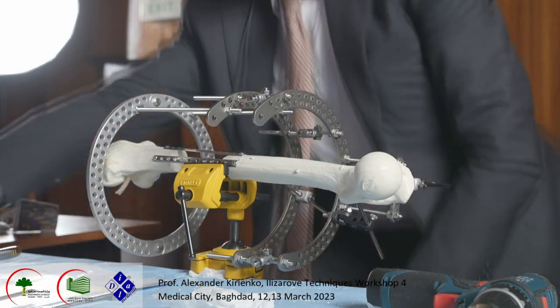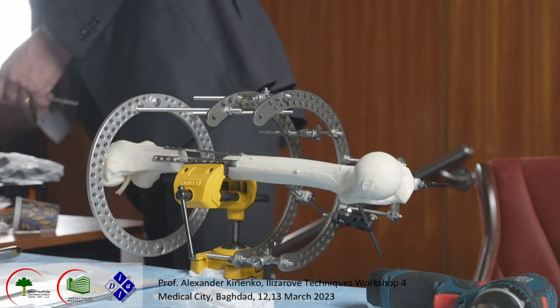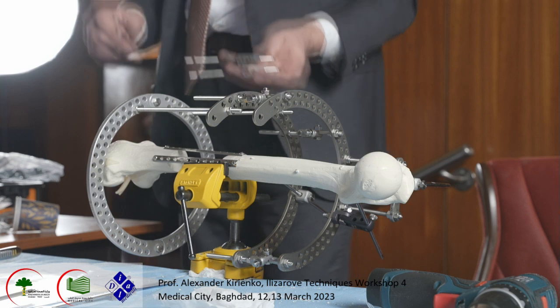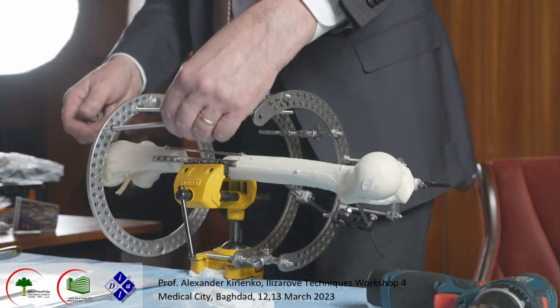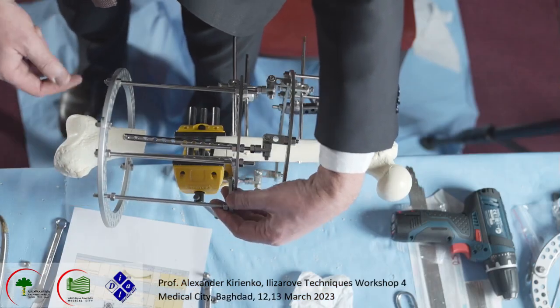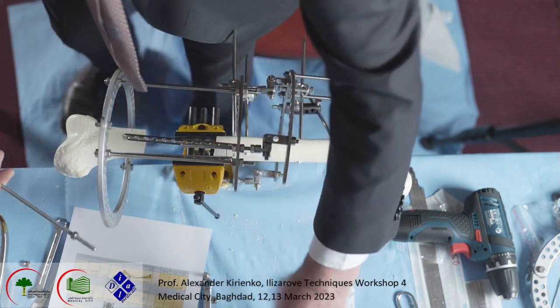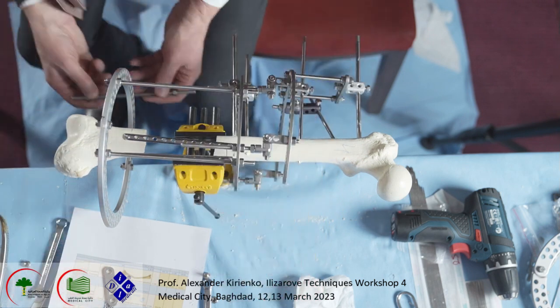If you have a smaller ring, you add a different plate, short, long, or something like this, in the way you connect the proximal and distal ring with this adjuster plate, and you compensate the diameter of one ring and the other ring. Now we have the same size, we don't need the plate, but that's only for understanding.